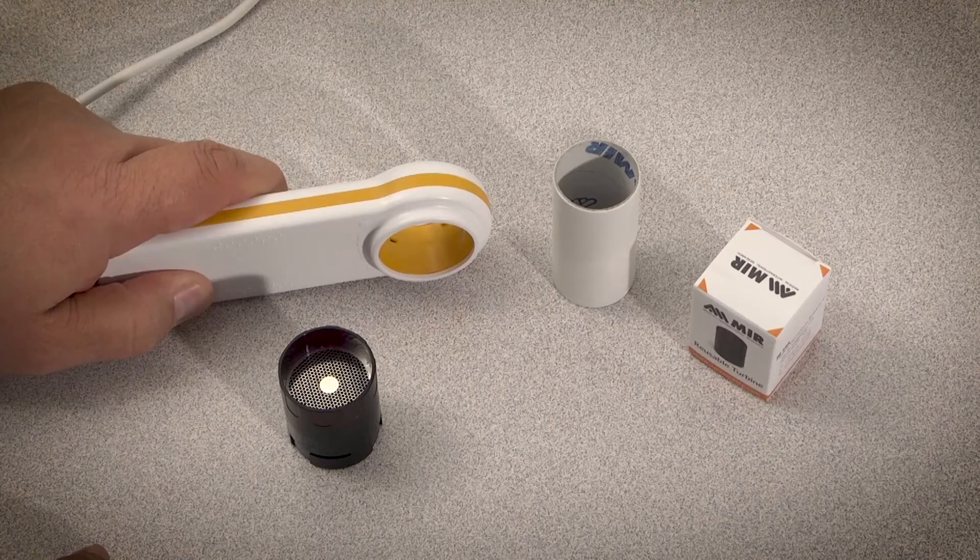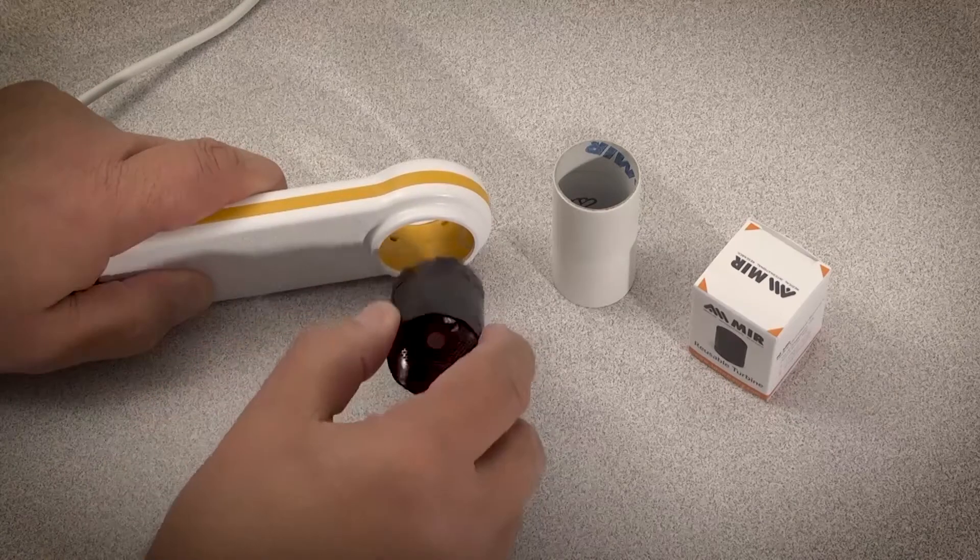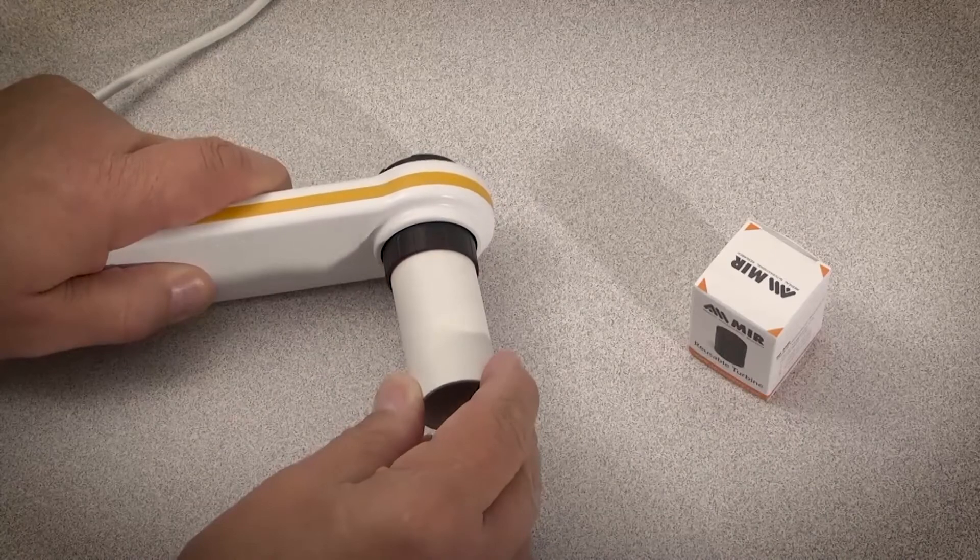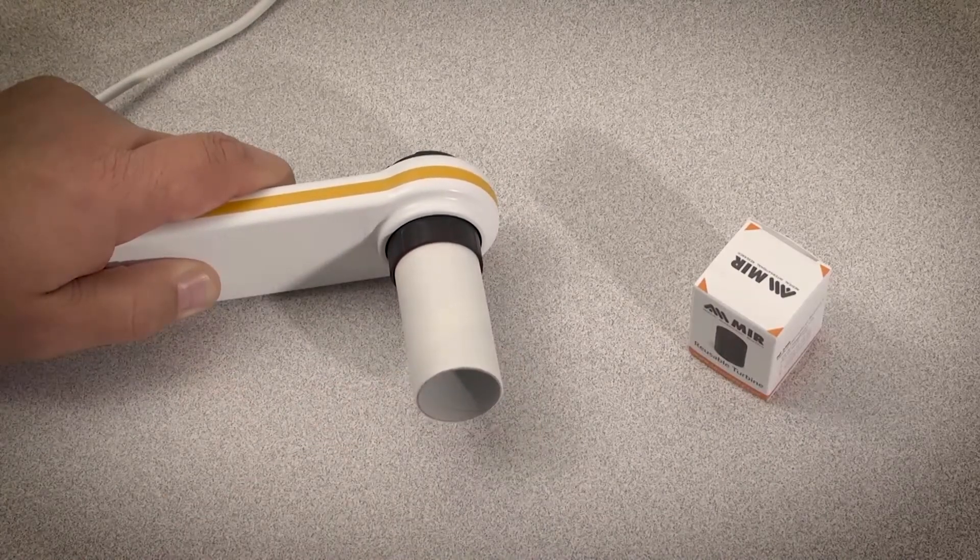To begin the calibration check, first insert the reusable turbine into the flow meter and then insert a cardboard mouthpiece into the reusable turbine.